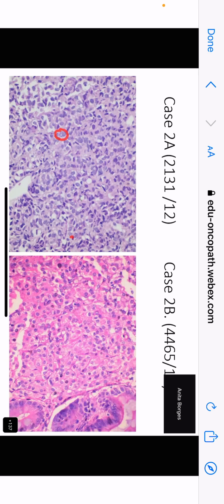I won't say that there is a lot of pleomorphism. Pleomorphism does not really come to me as a diagnostic term that I would use, but there is anisonucleosis. The shapes are also different. Some of them are round, some of them are irregular, some of them are oval. I would not say that there were prominent nucleoli, because the nucleoli just don't jump out at you.